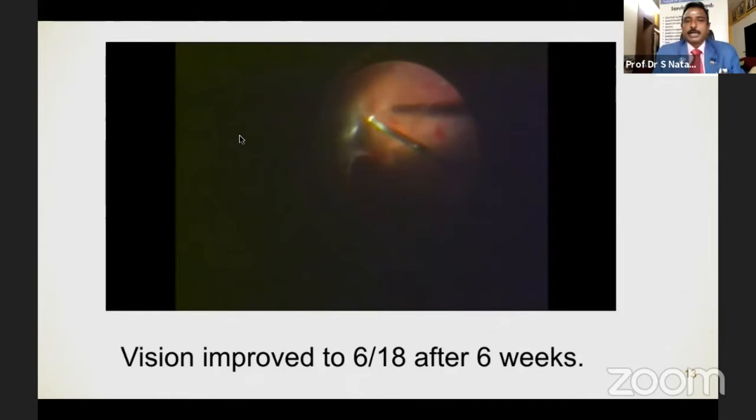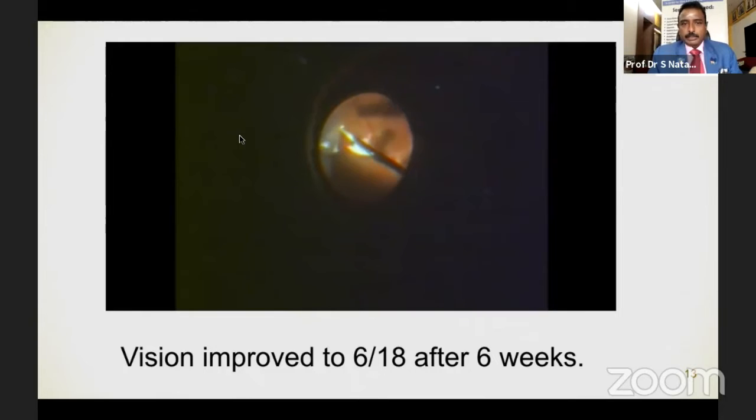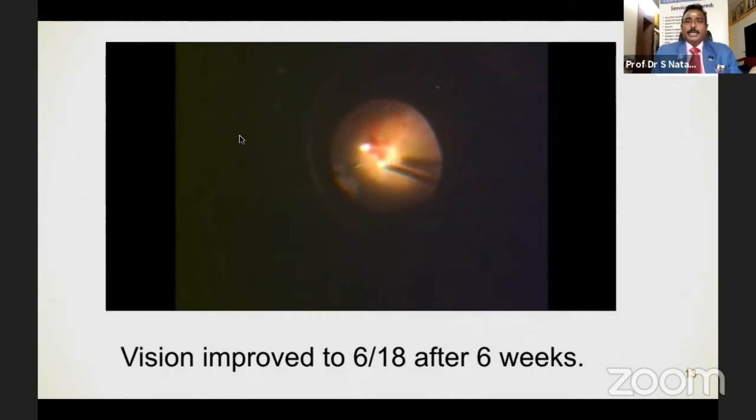You can see the vitreous hemorrhage is removed, and now the tangential traction is being relieved, and then you see the fibrovascular proliferation. I'm doing endodiathermy to make sure that bleeding does not happen. And I always keep the pressure at 20 and operate, because in diabetic eyes, there's a possibility of the optic disc becoming pale. And you see, in spite of the diathermy, there is some ooze, but I think you can again trim it and then use the diathermy on the bleeding fibrovascular proliferation. The whole idea is to remove the anterior-posterior traction and the tangential traction.